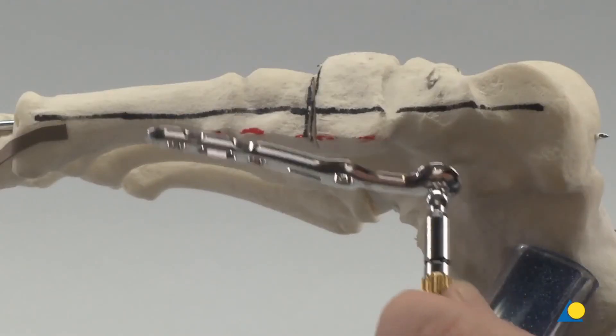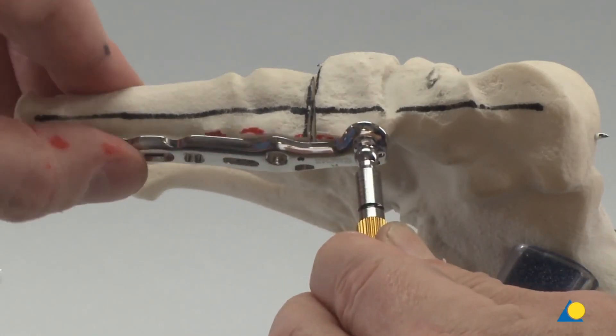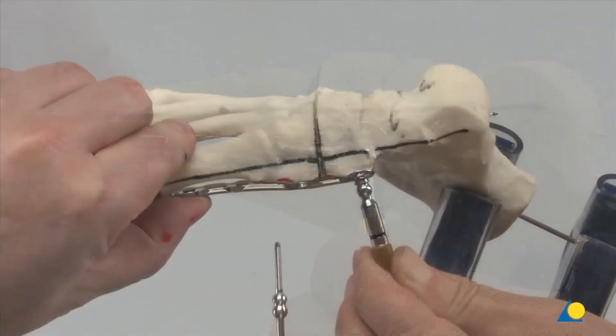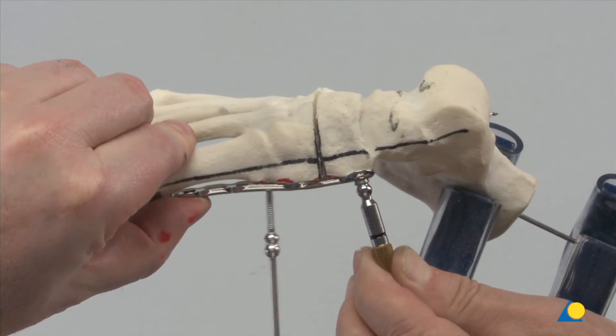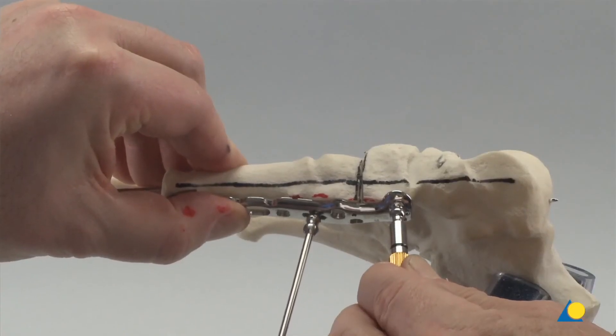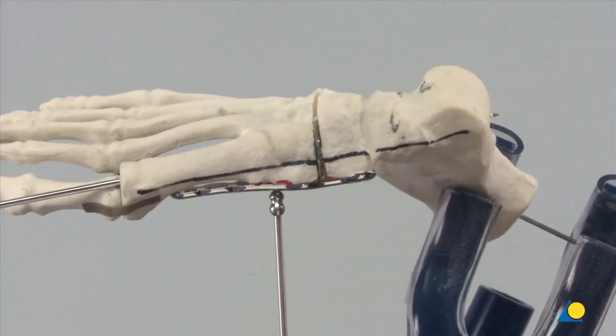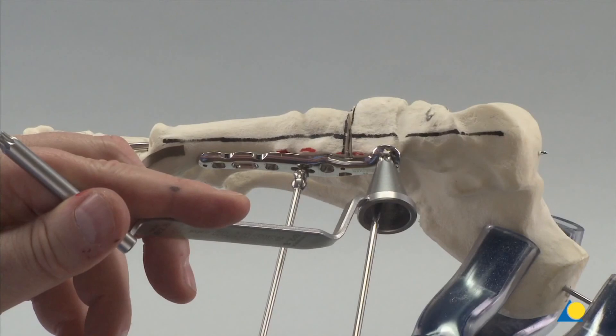The compression-distraction rod is used to position the plate so that two screws can be inserted in the navicular and cuneiform respectively, with the remaining screws in the first metatarsal. The plate is provisionally secured with a 2.8 mm compression wire inserted through the elongated screw hole in the metatarsal portion of the plate. The compression-distraction rod is then removed. A 3.5 mm VA locking screw will be inserted using a variable angle into the medial hole in the navicular part of the plate.